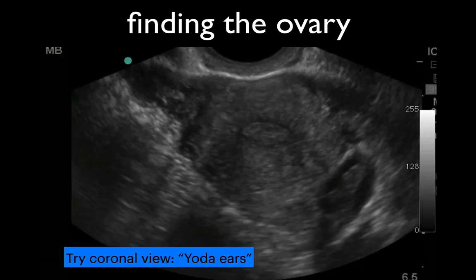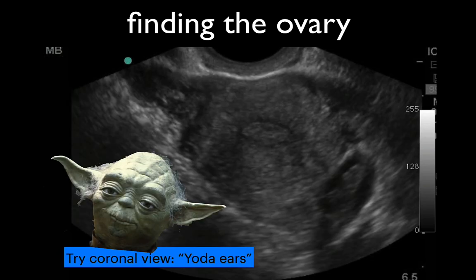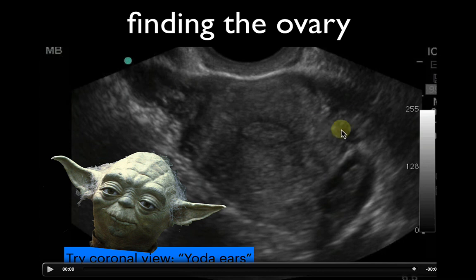Dr. Damewood likes to teach that this is Yoda. So here's the head. Here's one Yoda ear. Here's the other Yoda ear. This is a sad-eared Yoda on this side.